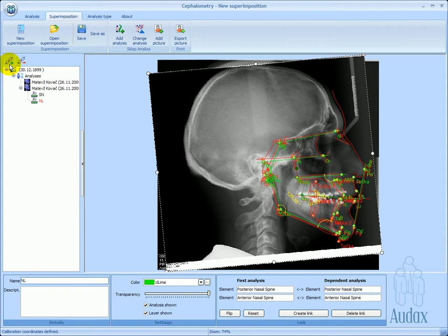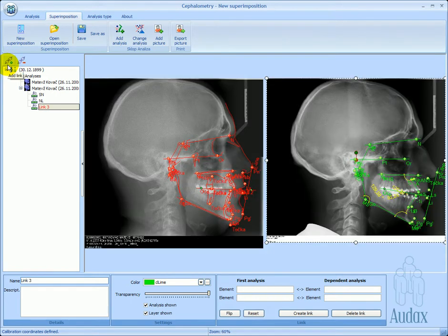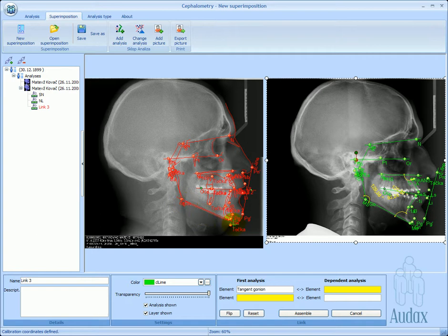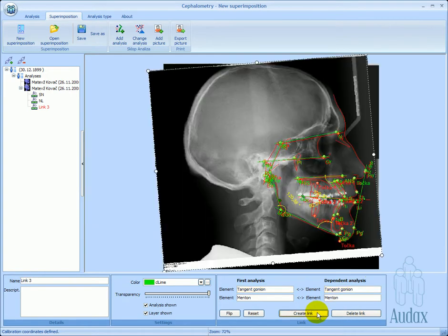The number of links between analyses in a superimposition is not limited, so we can create another one based on the position of the mandibular plane, where both the tangent gonion and menton from both analyses are connected.